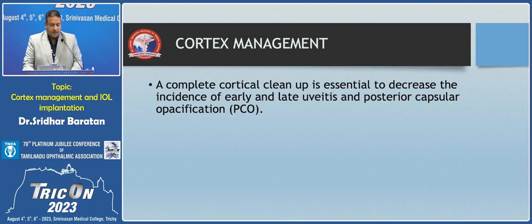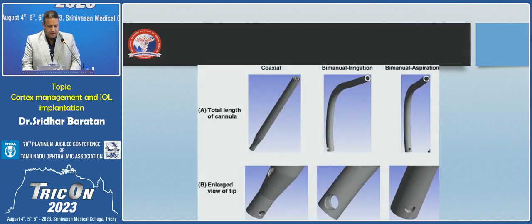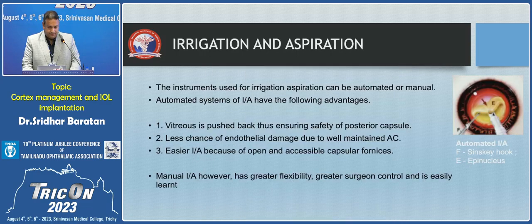A complete cortical cleanup is essential to decrease the incidence of early and late uveitis and posterior capsular opacification. The instruments that you use could be a coaxial irrigation aspiration system or a bimanual irrigation aspiration system. These are the various types of tips, and you can see the length of a coaxial cannula, whereas a bimanual has a slight bend here. And you can also see the openings in the tips that are present.